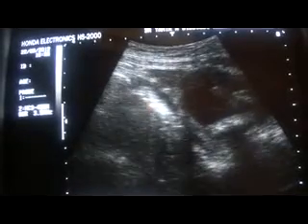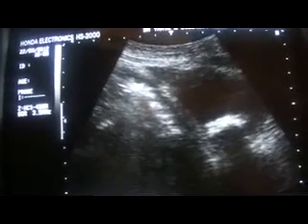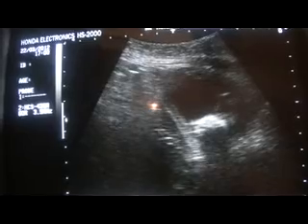This is the calculus giving posterior shadow in the urinary bladder in longitudinal section. This is the dense echogenic area giving posterior shadow — this is the urinary bladder, this is the wall of the urinary bladder. And this is the catheter bulb; the patient has been catheterized. The catheter bulb, if the patient is catheterized, will appear as a cystic area within the urinary bladder.